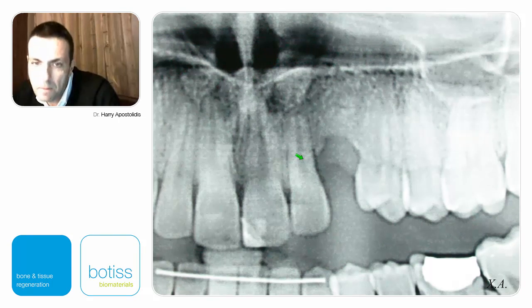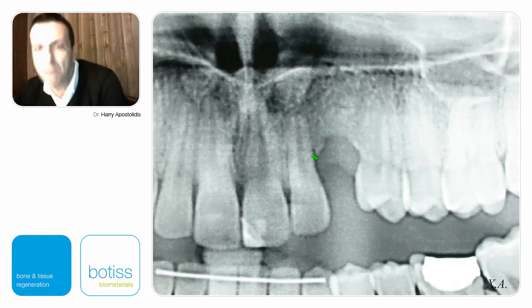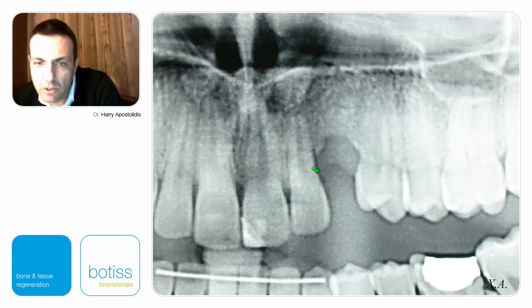before. Bear that in mind, we cannot graft on cementum. We only graft on bone, not on cementum. So the vertical component of this defect will be reconstructed up to here, not up to here, because the graft basically doesn't take on cementum.